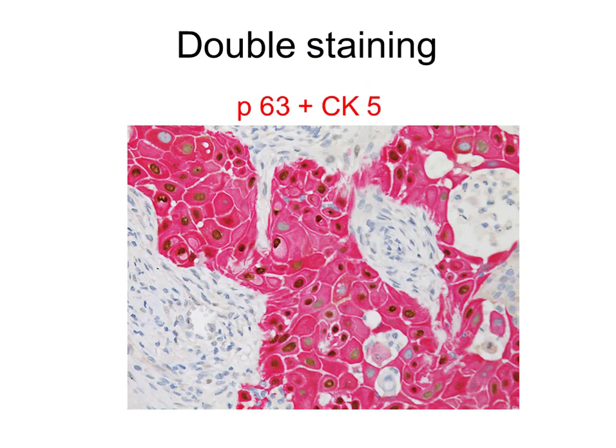One more method is double staining. When we have two markers in one tissue, one secondary antibody is labeled with one color and another with a second. For example, P63 is a marker which normally stains in the nucleus, and we have positive brown staining in the nuclei.